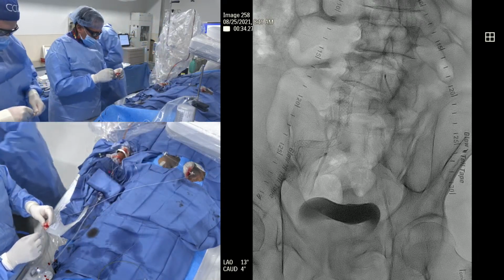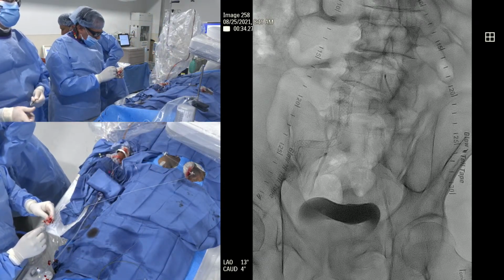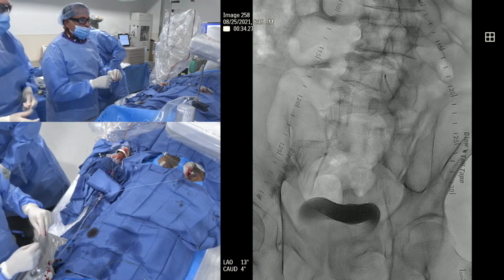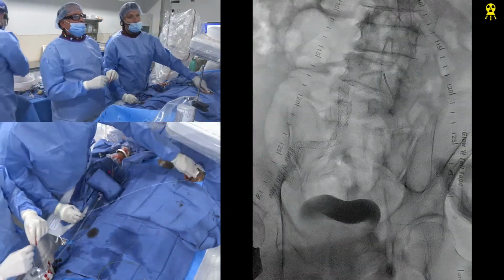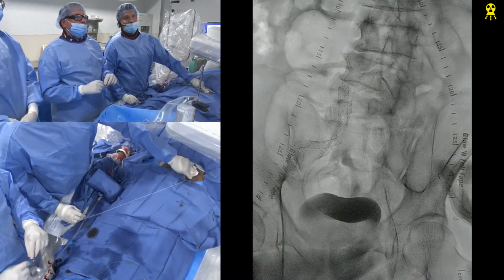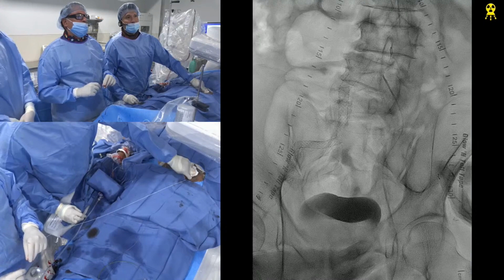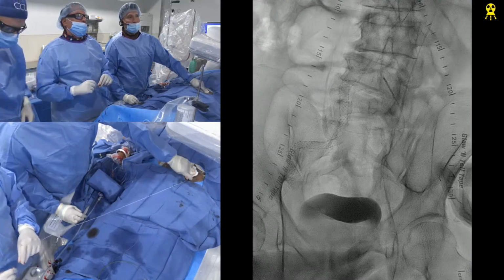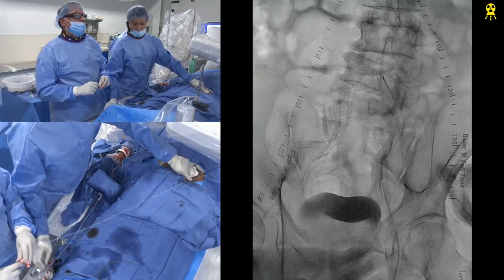Well, last time we got access, we didn't have this trouble, but we might have mucked up the iliac a little bit, which then causes a little bit of difficulty this time. Let's see. When the pigtail went through, it must have probably lifted up some plaque. That's what I'm saying. So that's also another situation. See, yeah, it's right there. There you go. Okay. Gonna follow it up.